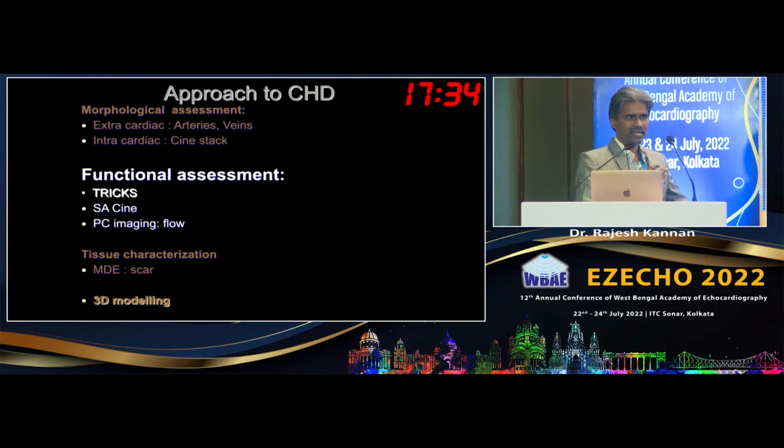All these anatomical information, maybe we can get easily with an echo, especially if the echo window is good in young people. But in a lot of people in India, they come at the age of say 10 years, 15 years, even 20 years after an initial surgery. If you want to assess them post sternotomy, the echo window may not be good. In those cases, MRI will be very, very useful.